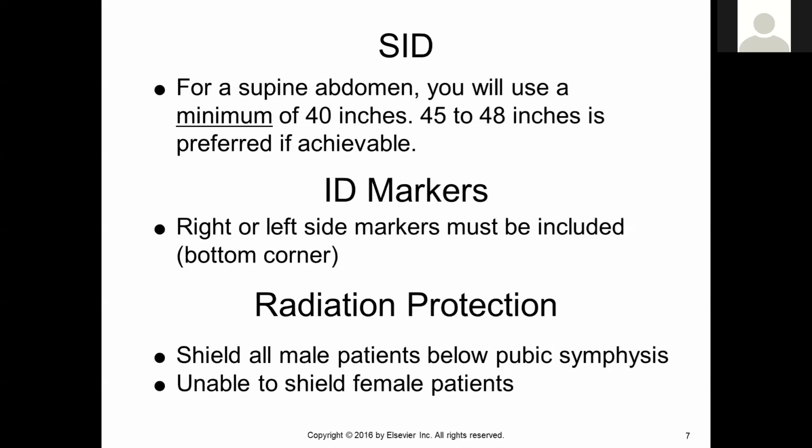That makes your check for possible pregnancy so much more important. And you might even emphasize to your patient, I can't shield you for this image. So just double checking, no chance of pregnancy. Some facilities may even order a pregnancy test for imaging below the diaphragm.